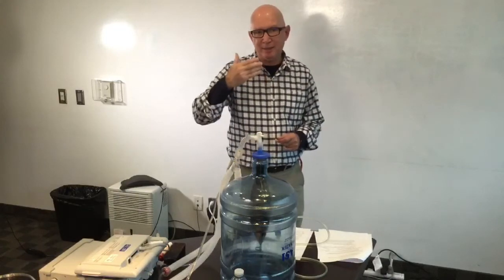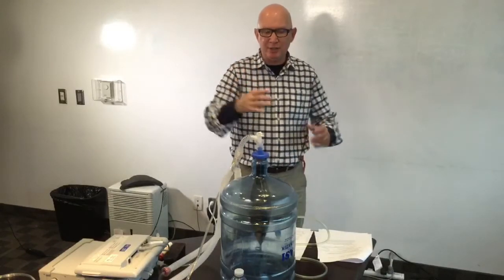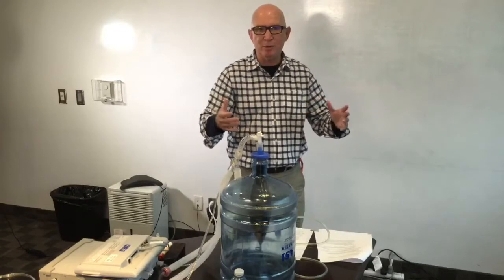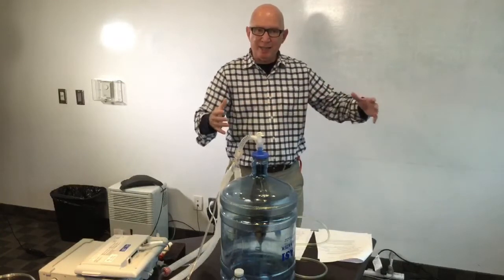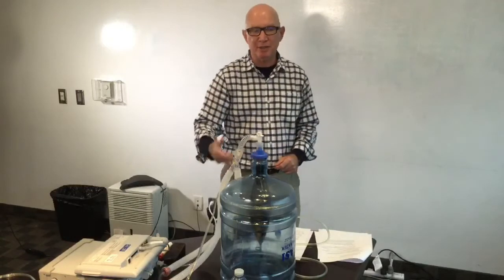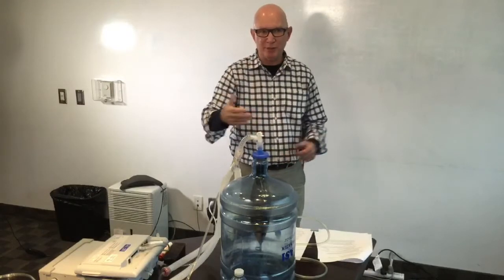It could either mean that someone's breathing at a rate of, say, 30 to 40 breaths per minute, and it doesn't allow complete exhalation, so there's a continuous, dynamic increase in the lung volume, or the FRC. And the end result of that will be a lung that is full of gas at the end of expiration and has very little room for the next tidal volume delivery. So pressures rise if you're in volume control, and tidal volumes fall if you're in pressure control when that happens.